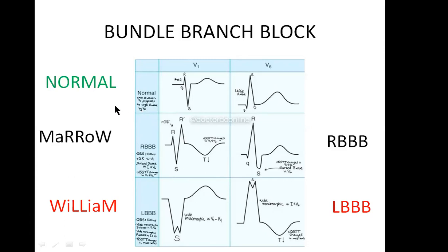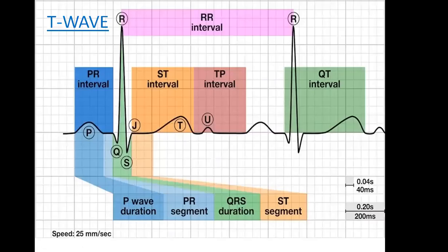And in third degree heart block, the QRS complex will be widened. Time is very short. I am already short of time. I will quickly try to cover the rest in 5 minutes. We have almost finished the points.